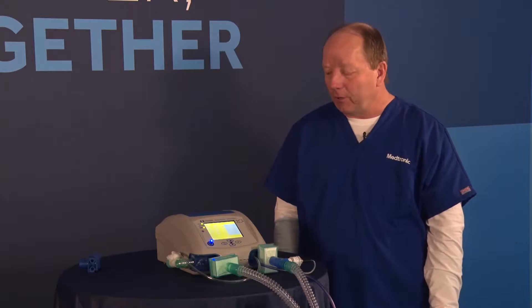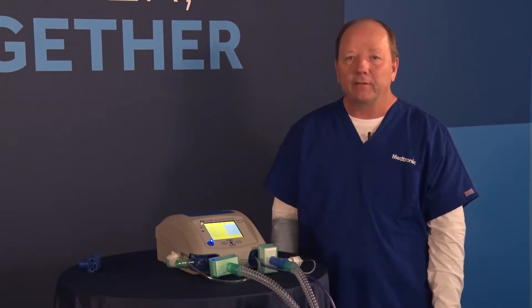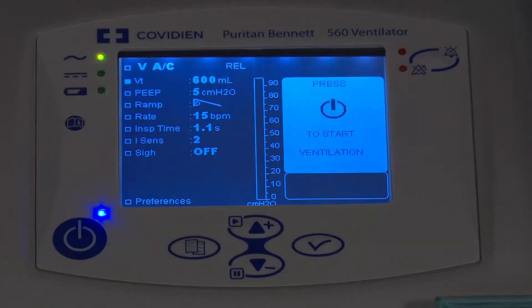Now let's talk about navigating the screens on the Puritan Bennett 560 ventilator. I've turned the unit on and let's begin to look at how we navigate through things. On the screen, we can see the current settings left on the ventilator. Right now we're in volume-based ventilation in assist control, and we can see tidal volumes and PEEP below it.